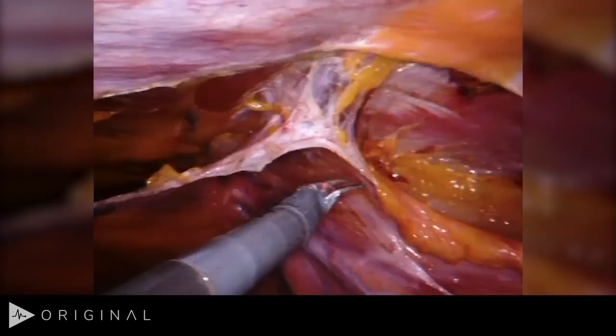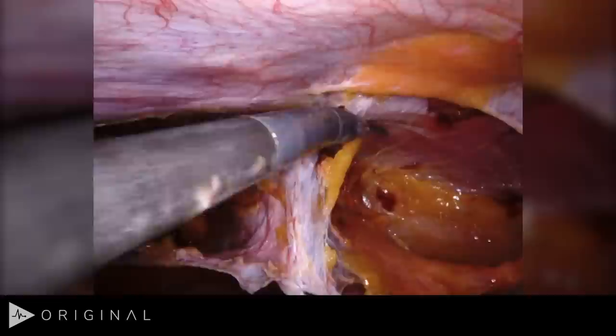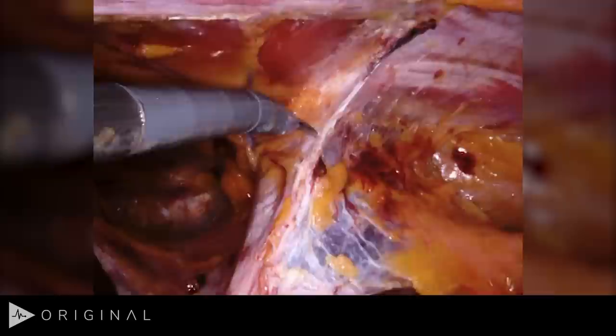Now I'm going to tackle the medial dissection — this is the hardest part. He's got a giant indirect hernia. Our job is to reduce that, but we can't injure the testicular artery, vein, and vas deferens when doing so. Let's take our time. This is the lateral attachment of the transversus fascia going to the linea semilunaris — it looks like peritoneum but it's not. We want to complete our division of that.